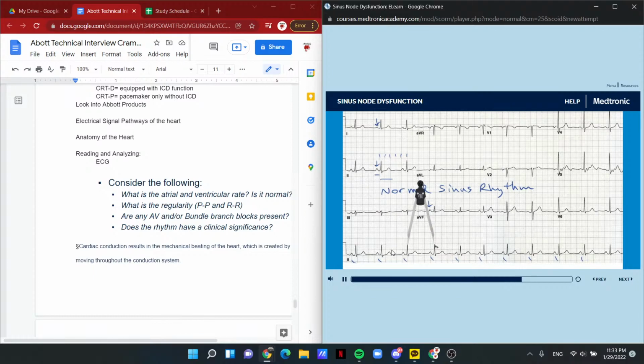But this one, for example, is a little bit longer, whereas this one is a little bit shorter. There can be a cyclical change in the heart rate that's considered normal and is referred to as sinus arrhythmia. It's due to changes in the rate of firing of the sinus node due to slight alterations in the autonomic tone, in particular the parasympathetic tone carried by the vagus nerve.